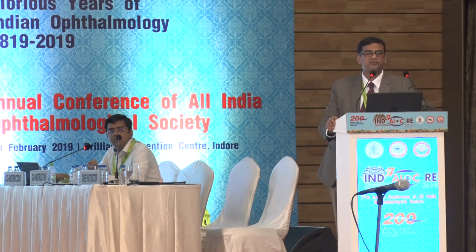Hello. Can we measure angle kappa with a synoptophore or a placido-based topography machine? You can do the synoptophore also. The Lenstar has it, the Zeiss IOL Master has it. Because everybody cannot have a 700 IOL Master. No, if you want to measure it, a synoptophore can do it. But as I told you, there's a small device which Aurolab has now come with, which is very, very less expensive. We can add it on to your slit lamp, and it can be measured.